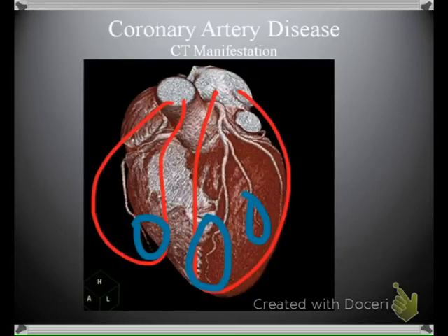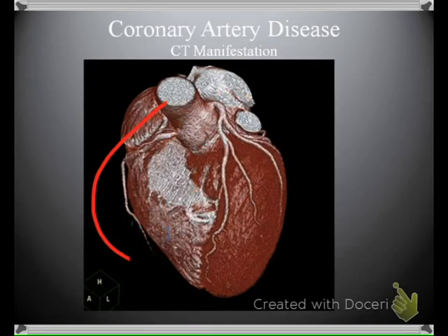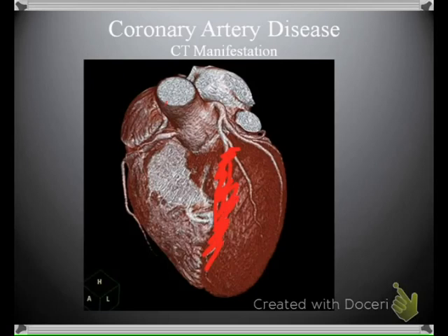What we rely on in terms of CT, or CTAs, in terms of volume rendering such as this, are complete filling defects. And when we speak of filling defects, we mean something like this portion is not showing up. We're not seeing this area here. And so we rely on significant filling defects for 3D reconstruction, which sometimes is not always the case.